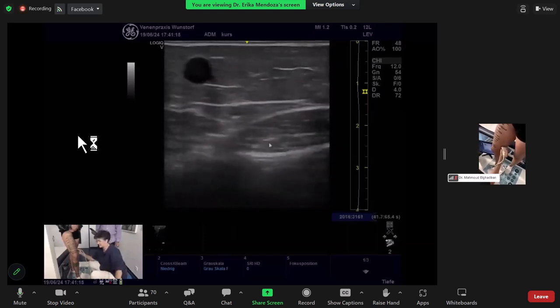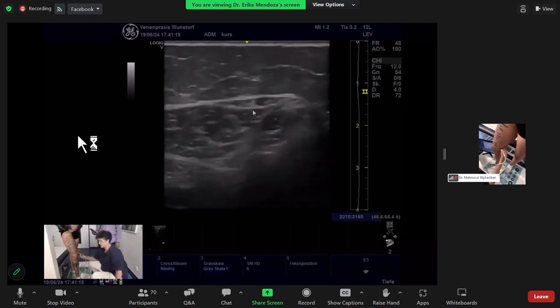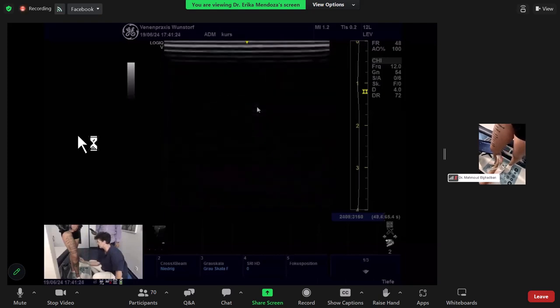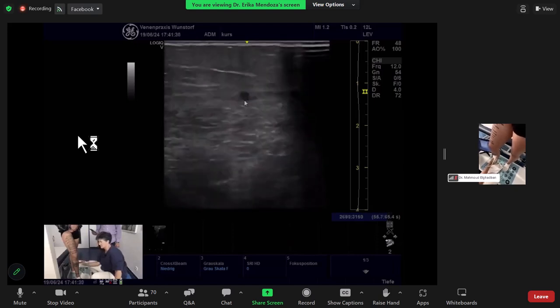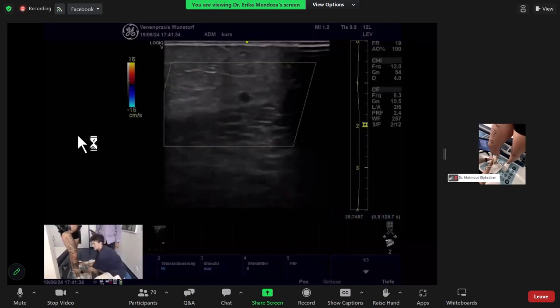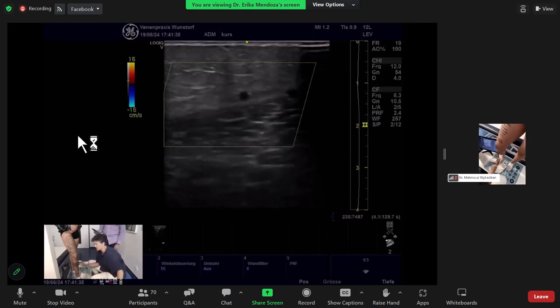So now we have here the saphenous vein, the tributary. We go down the saphenous vein, which is really tiny, perfectly healthy. There it is. Very little. We just check. It doesn't talk to us nearly because it's so healthy.